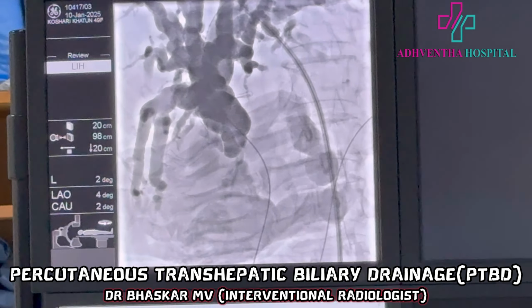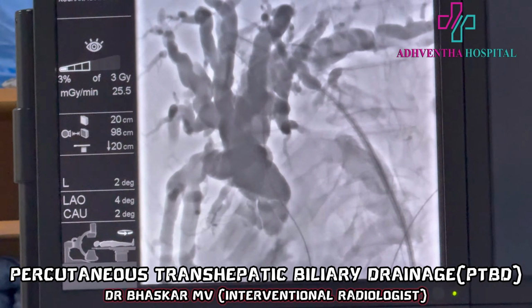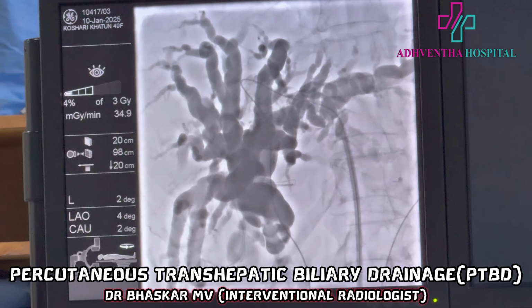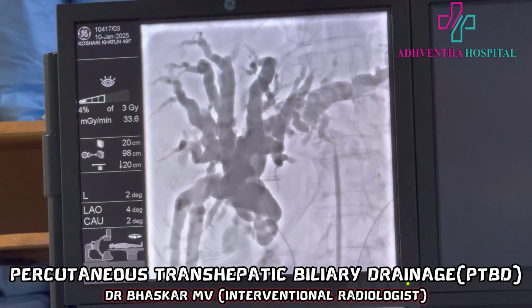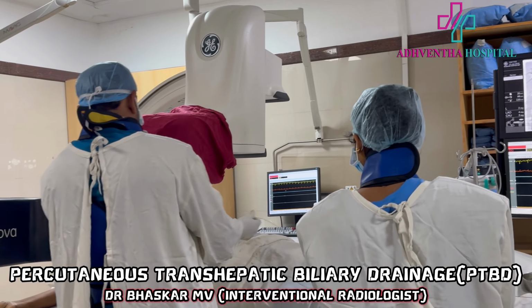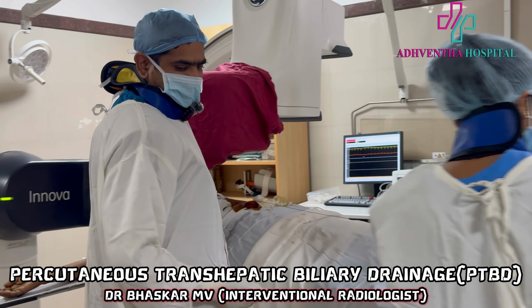Can you show up? See? Okay. That is a little bigger dilator. That is done. Does it hurt? No? No pain for the patient.